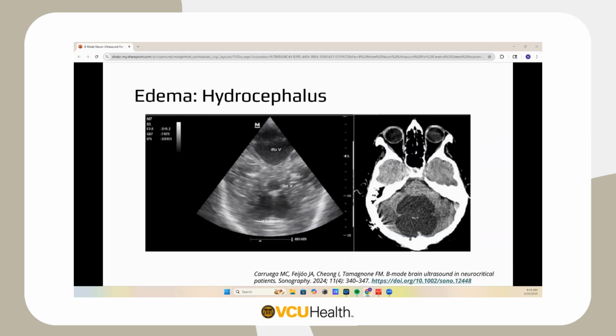So this is actually my last slide and last image, and it's an unproven way of assessing cerebral edema, but it's quite a unique shot of a 54-year-old patient who had a diagnosis of subarachnoid hemorrhage, who unfortunately had her ventricular shunt obstructed. But by placing the probe through the occipital window, at the base of the occiput, you can see the corresponding enlarged ventricular spaces.